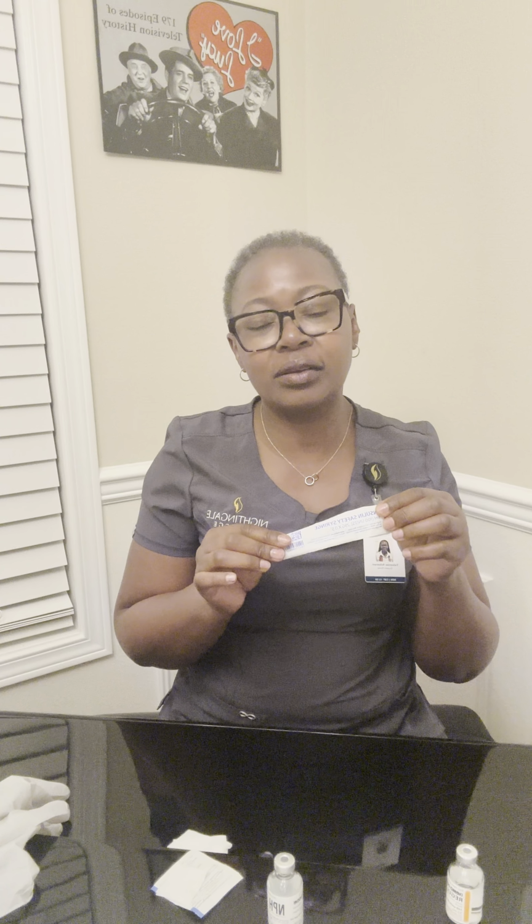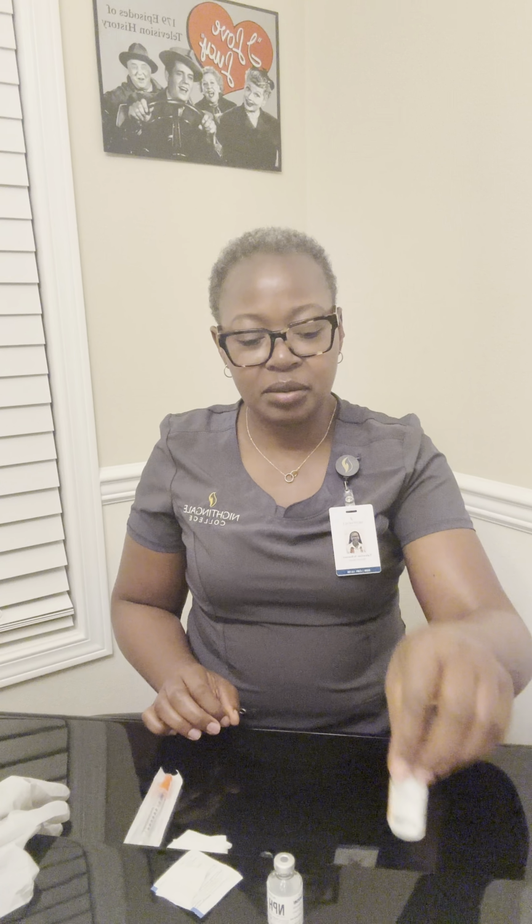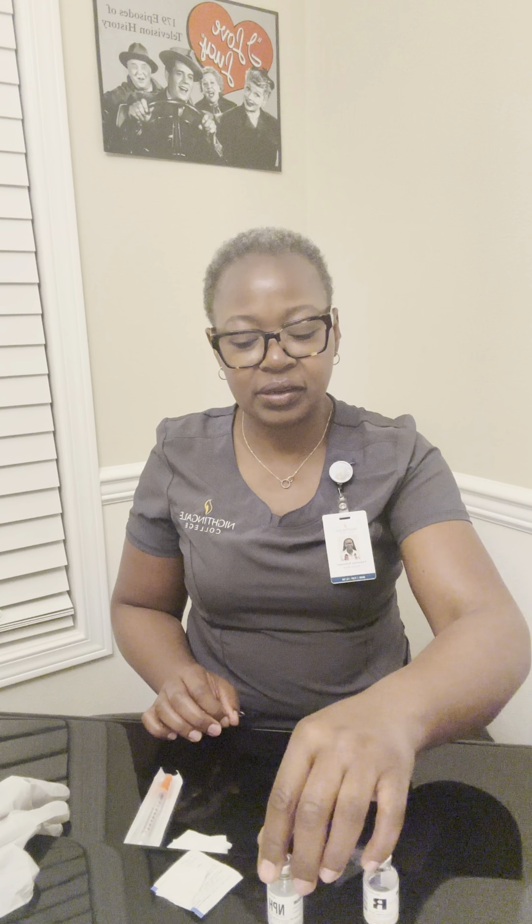I'm here to draw insulin, and I have assembled my materials. I have a 1 ml syringe of insulin with a 29 gauge needle. I have my insulin, short acting and intermediate acting. I have gauze, and I have clean gloves.